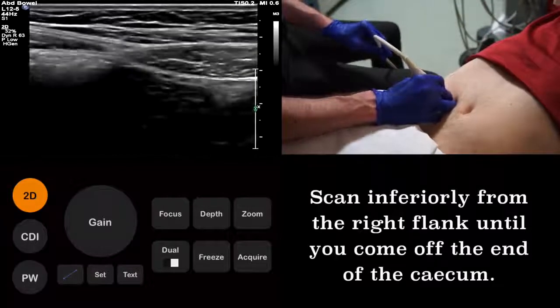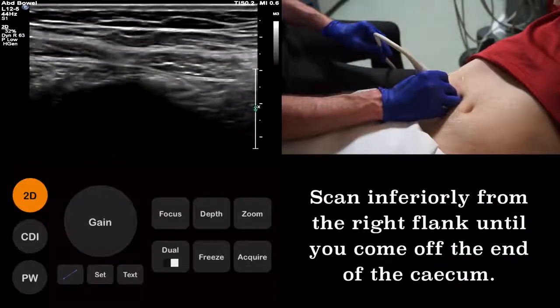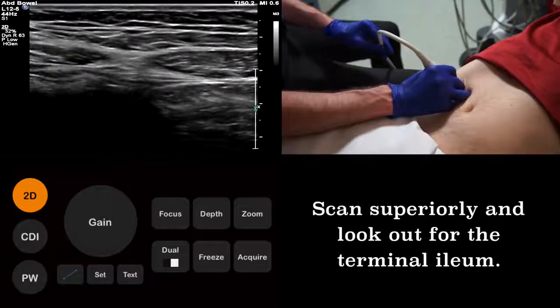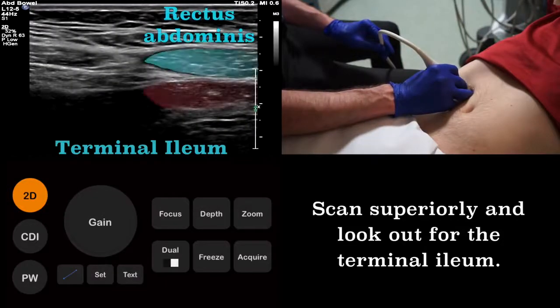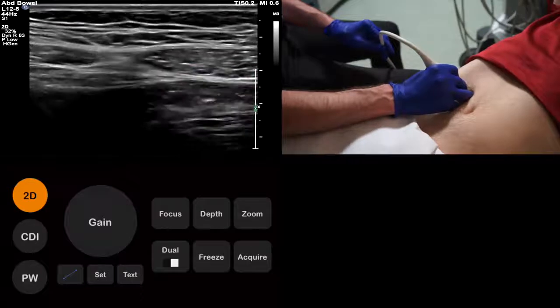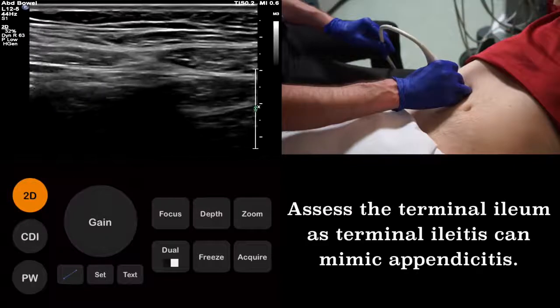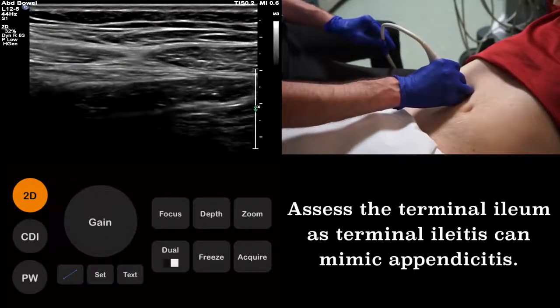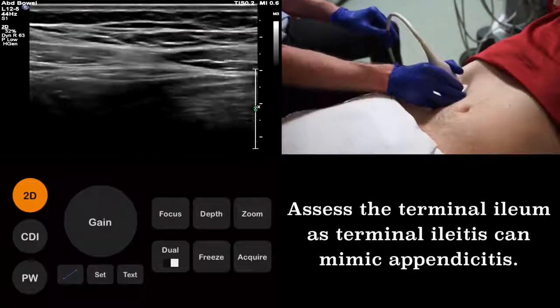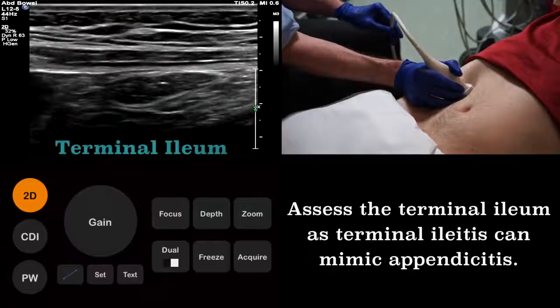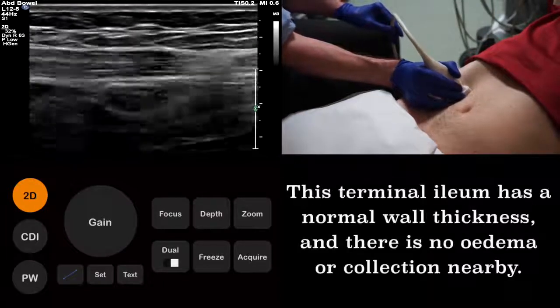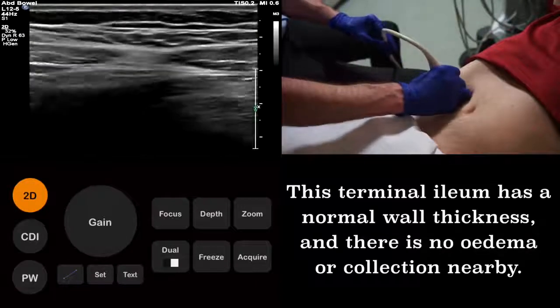Just as before, we start in the right flank, scanning down onto the cecum, and then back up to identify the terminal ileum. Here we see the terminal ileum lying just deep to the rectus abdominis muscle. Unlike the ascending colon we imaged before, the small bowel does not have haustra, and therefore has a smooth wall contour. We image the terminal ileum in its axial plane, looking for signs of inflammation. The terminal ileum shown here has a normal wall thickness, and there is no surrounding edema or collection.